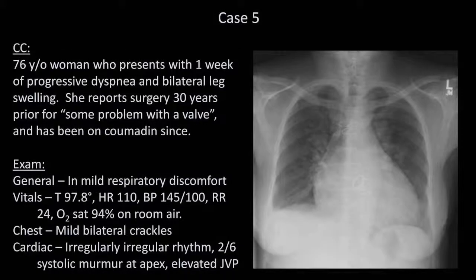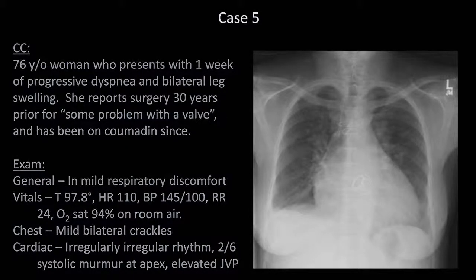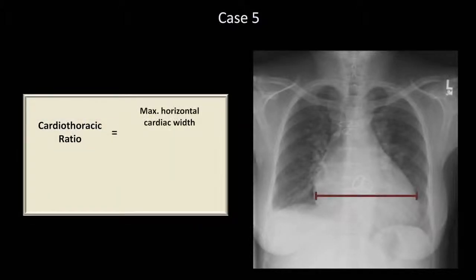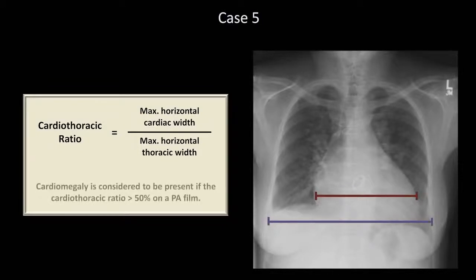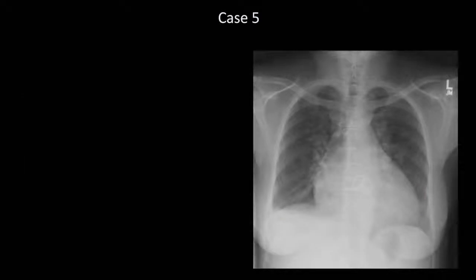Case 5. A 76-year-old woman presents with one week of progressive dyspnea and bilateral leg swelling. She reports her medical history is most notable for some type of heart valve surgery 30 years ago. The first thing you probably noticed is her cardiac silhouette looks large. The cardiothoracic ratio is equal to the maximum horizontal cardiac width divided by the maximum horizontal thoracic width as measured between the inner rib margins. Cardiomegaly is considered to be present if this ratio is greater than 50% on the PA film, which it clearly is in this case.